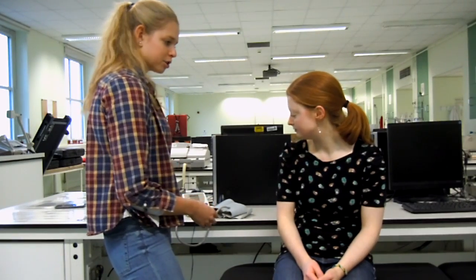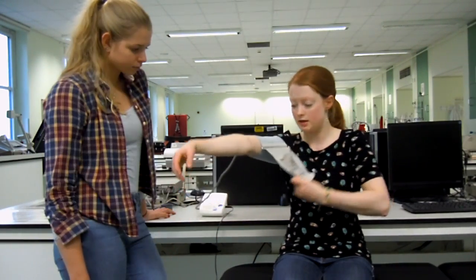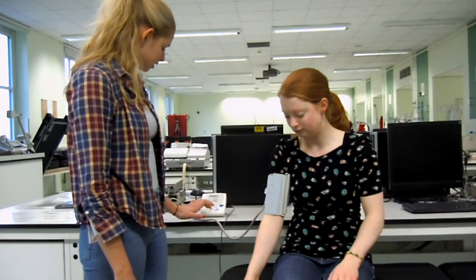The second part is blood pressure. Take the cuff, slide it onto your arm just a little bit above the elbow, and pull it tight so it's nice and secure. You're going to click the on button and then press the go button. Just remember to keep relaxed.